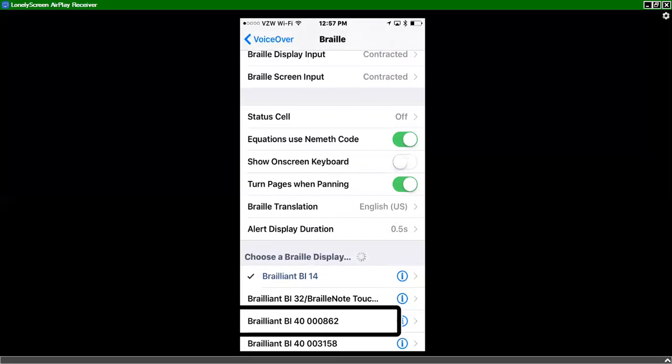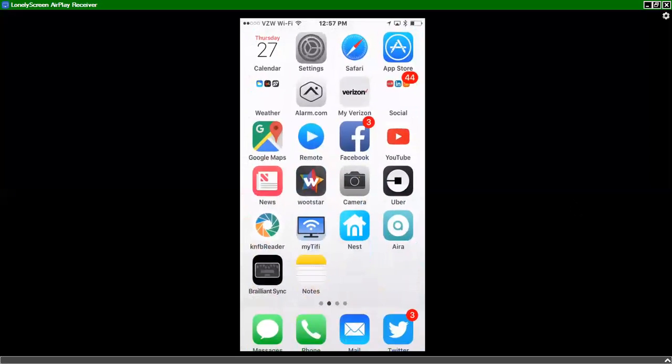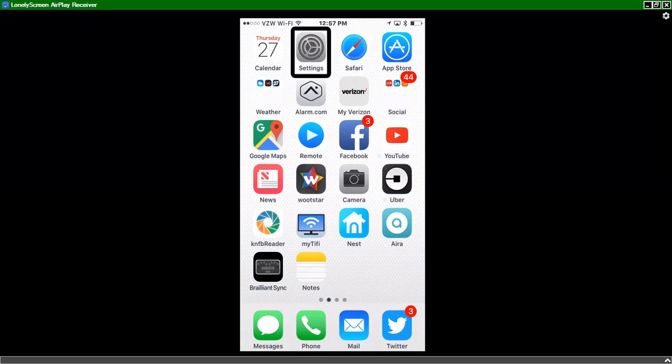And at this point now, the Brailliant BI 14 is paired up with my iPhone and I can press space with H. And we go right to the home screen. Brailliant BI 14. I can now use the Brailliant's simple to use joystick that's on the front of the device to flick it right, left, up, or down to simulate my swipe gestures on my iPhone. So I'll do that now just by flicking the joystick to the right.